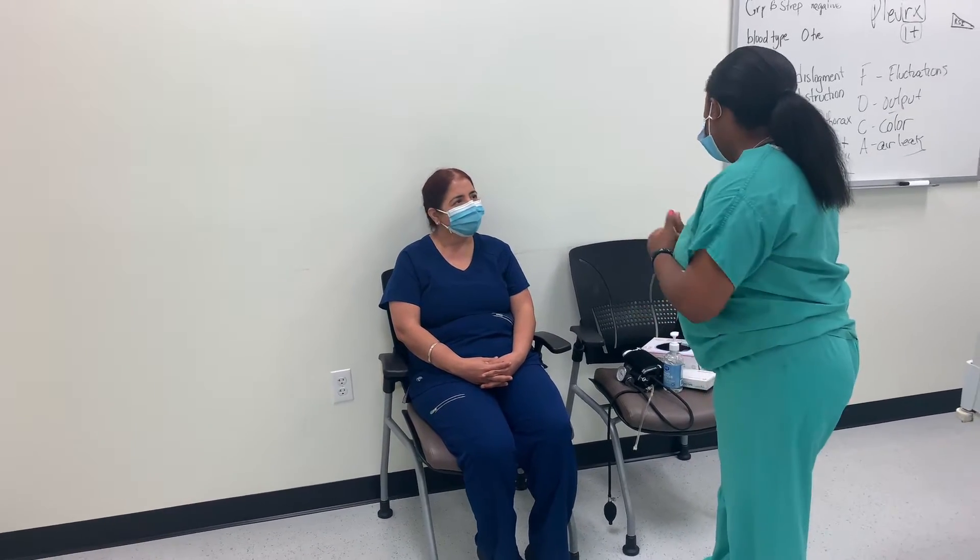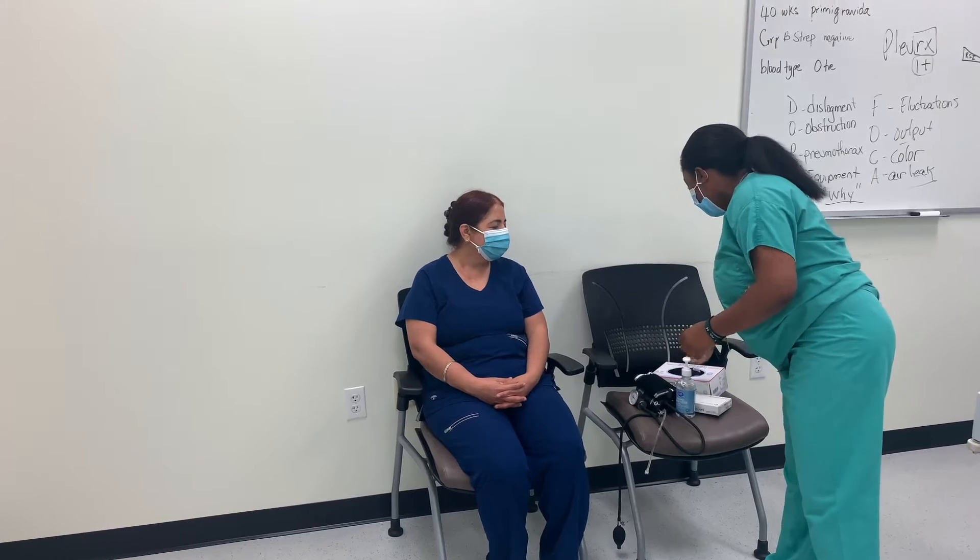I do have my patient here. I already know what she normally runs — she's not normally hypertensive, her history is really good. That way we can know when we should be alerted by a specific number, because we treat patients, not machines. So I have my hand sanitizer, making sure we're doing hand hygiene. I have my gloves. I've already told my patient exactly what I'm going to be doing, so she already knows, and I've already identified my patient.